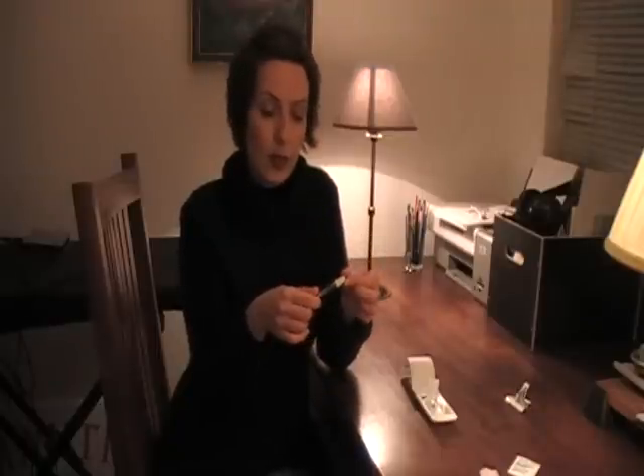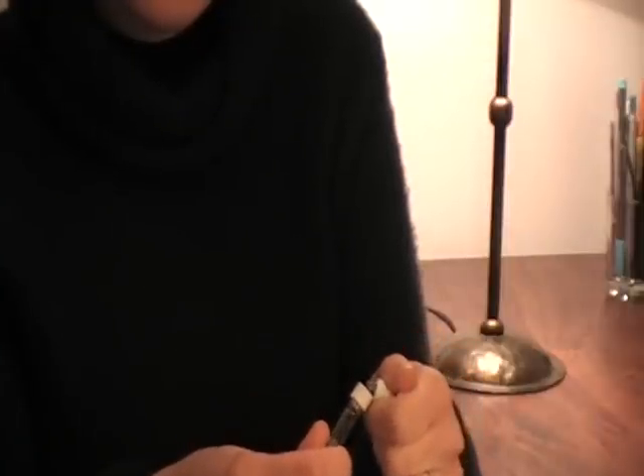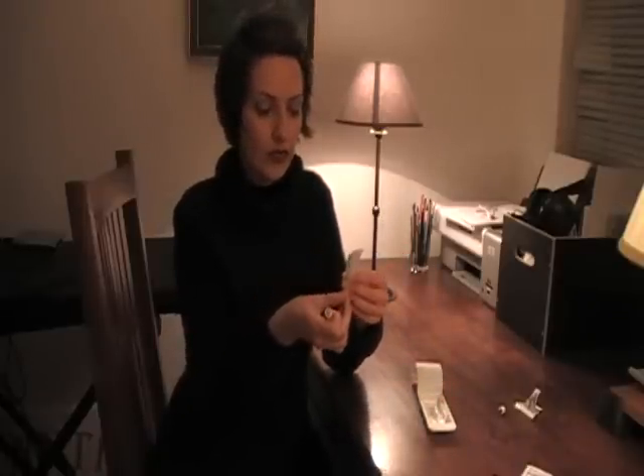This is the pre-filled syringe. What you need to do is remove this top part — you'll click it off, and after you do, do not touch the inner part, because that needs to stay sterile. When you take it off, you're going to hear a very loud click, which sounds like you're breaking the glass. You're not. Next, you'll take your needle and attach it, again without touching the blue part.